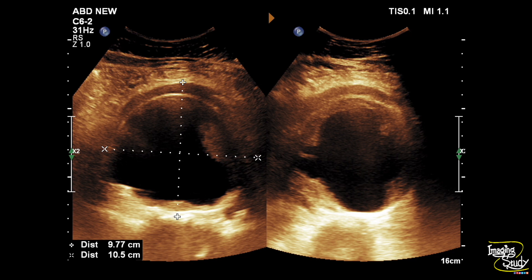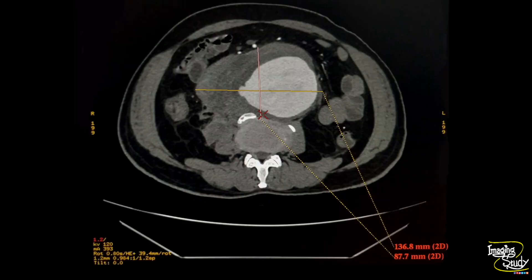Let's see what measurement we got from the CT angiogram. Here's the axial post-contrast section. You can see the mural thrombi quite well here, and this is the free part of the lumen. The margin is irregular and the highest transverse diameter at this part was 13.6 centimeters, which is different from the highest measurement done on ultrasound.